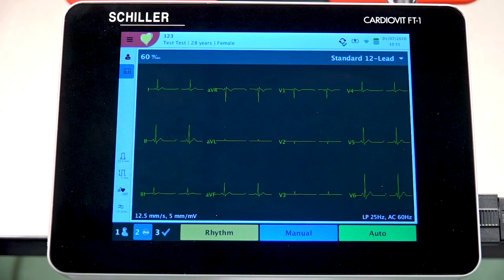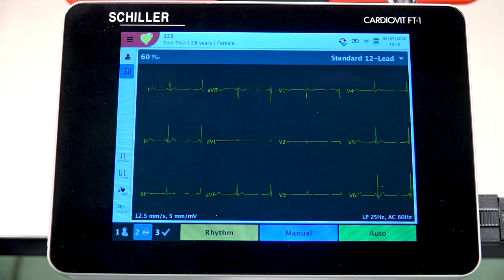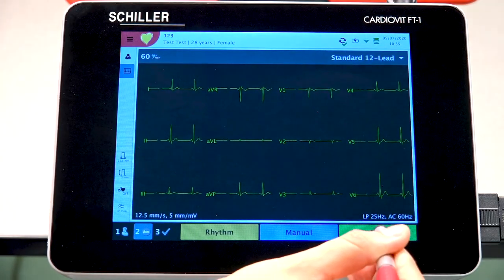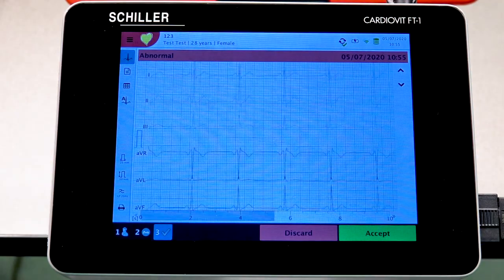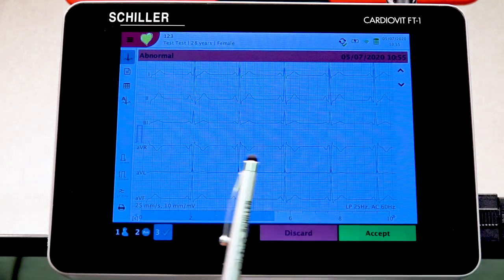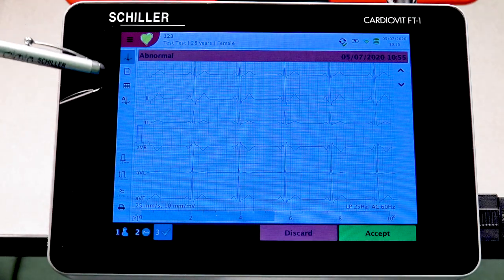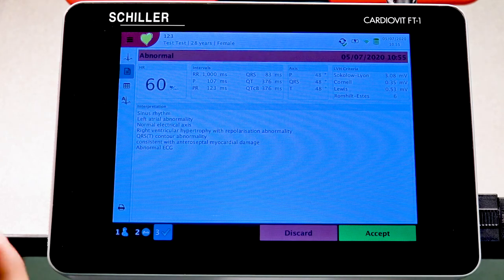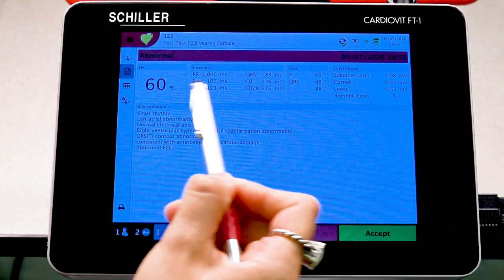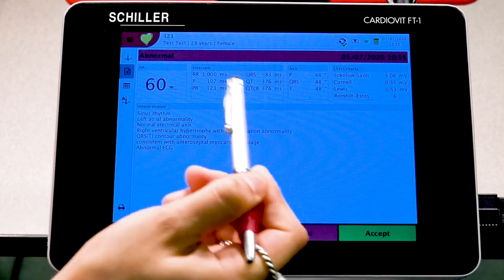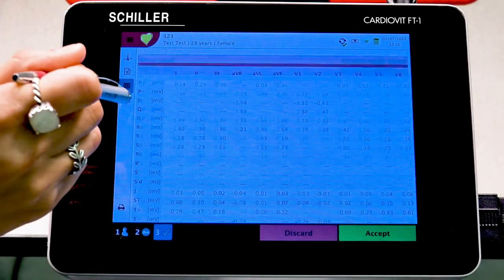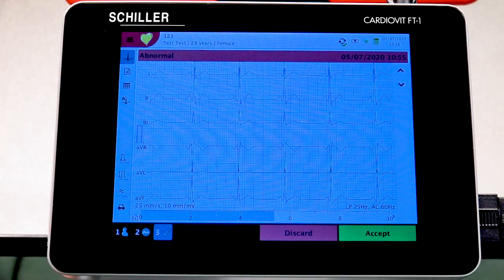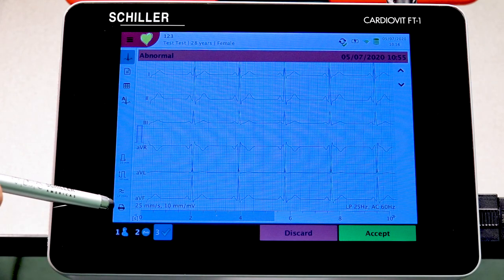After verifying that your signal is good and you're ready to take the ECG recording, press the Auto tab at the bottom. The next screen will show your actual ECG report. The additional tabs on the left contain important values, measurements, and interpretation. If you choose to print the report, press the printer icon.